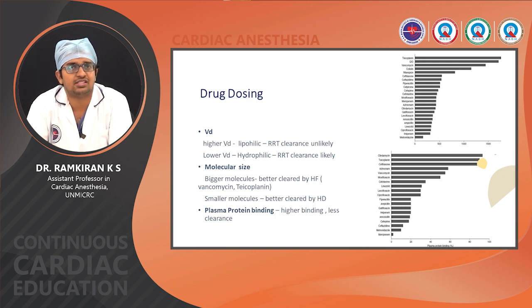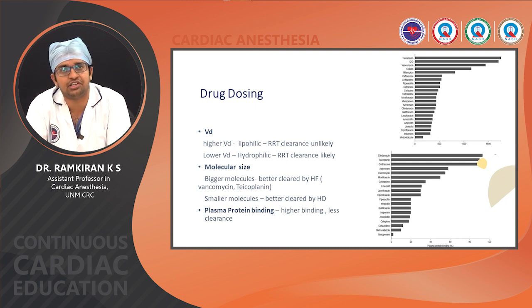Coming to the molecular size, bigger molecules are always better cleared by hemofiltration, whereas smaller molecules are better cleared by hemodialysis.